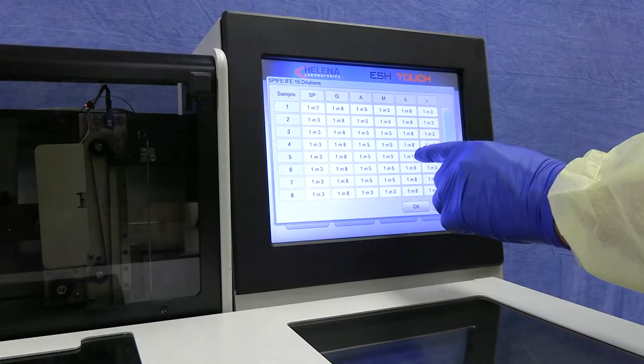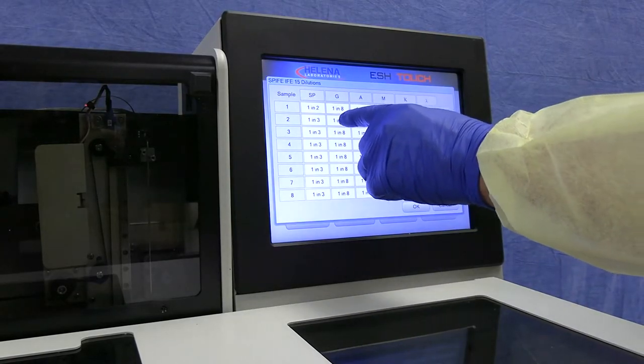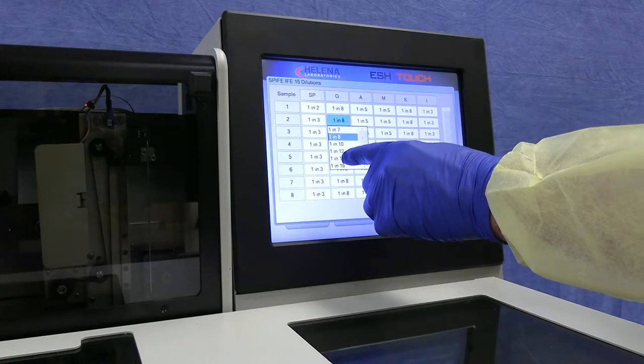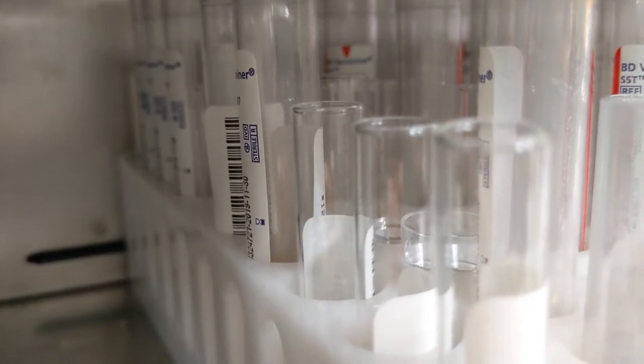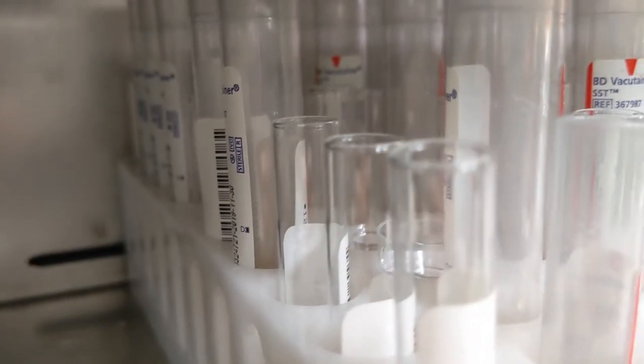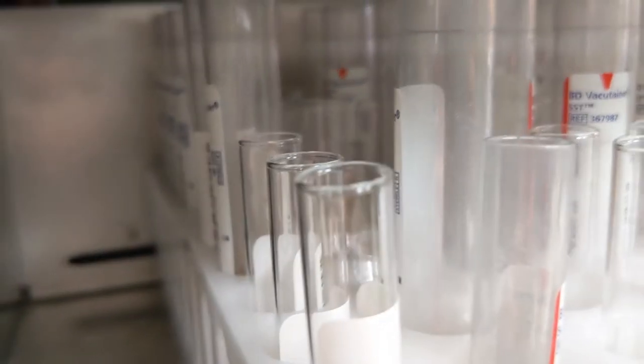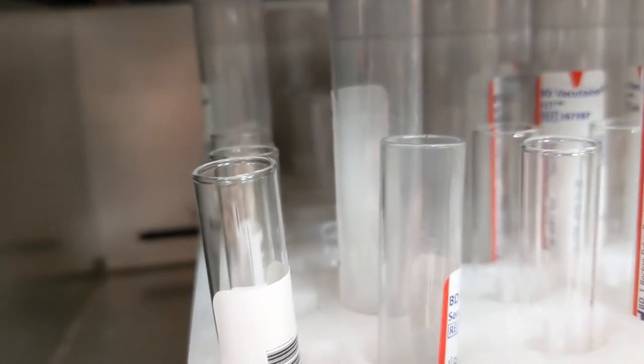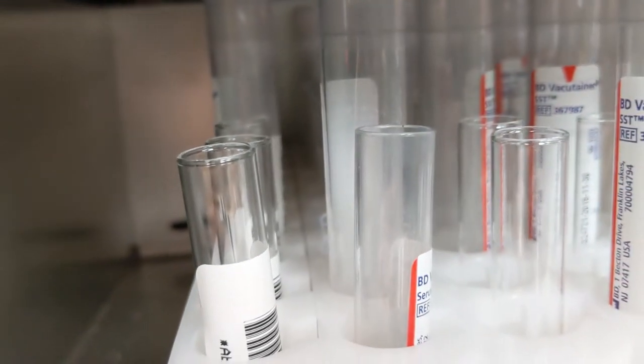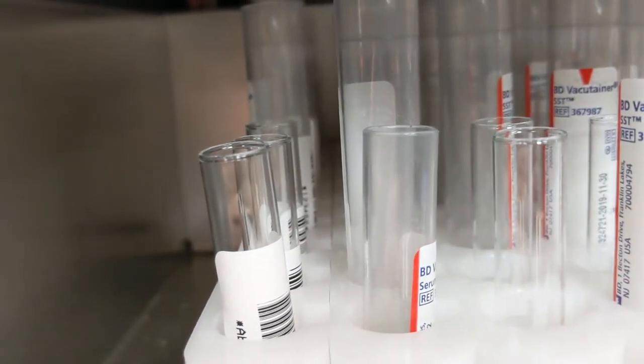If a sample requires specialized dilution, the touchscreen interface makes it simple to choose from neat up to 1 to 20 dilution. Tube sizes can be variable in each rack, with excellent liquid level sensing depending on the tube size.